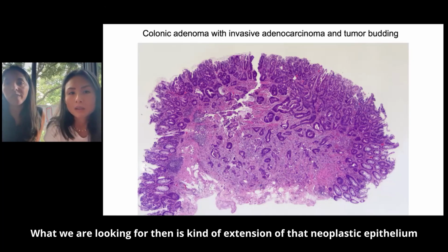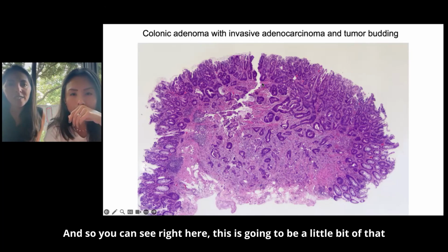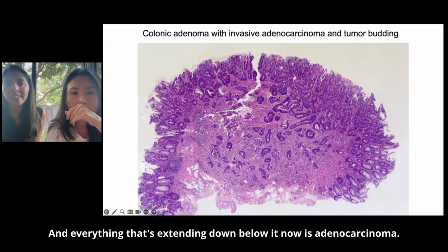What we're looking for then is kind of extension of that neoplastic epithelium down below our muscularis mucosae, because we know that that is going to be our boundary for the mucosa. And so you can see right here, this is going to be a little bit of that strip of that pink smooth muscle we were looking at. So everything above it would be kind of more of an intramucosal adenoma, right? And everything that's extending down below it now is adenocarcinoma.